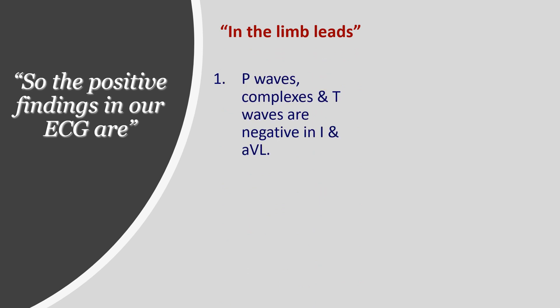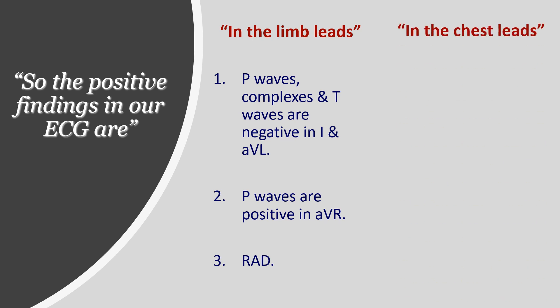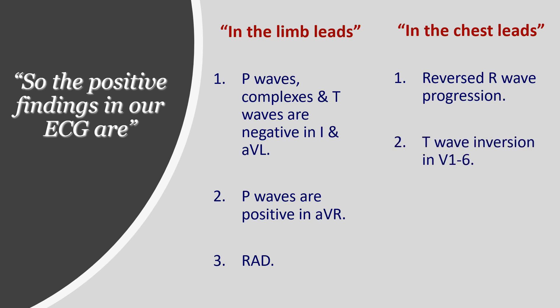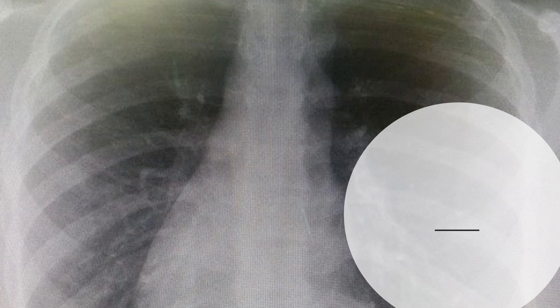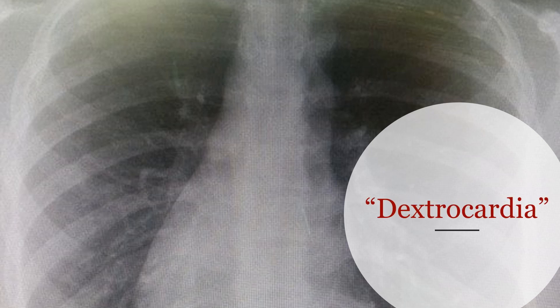In summary, the positive findings in this ECG are: in the limb leads — P waves, complexes, and T waves all negative in lead I and AVL; P waves positive in AVR; and right axis deviation. In the chest leads — reversed R wave progression, T wave inversion from V1 to V6, and QRS complexes getting smaller from V1 to V6. Combining all these findings leads to one single diagnosis: dextrocardia.